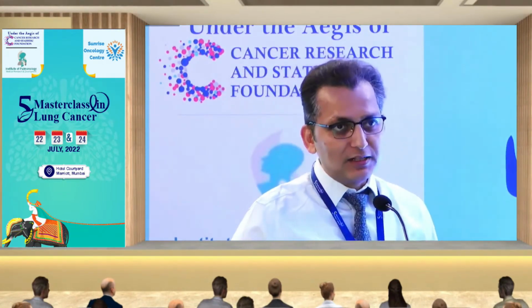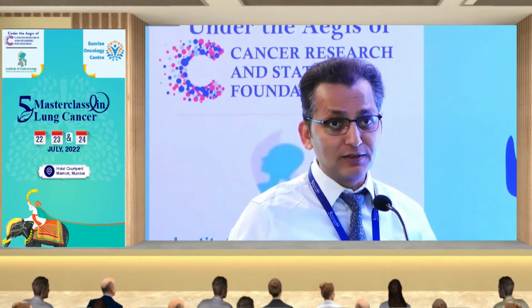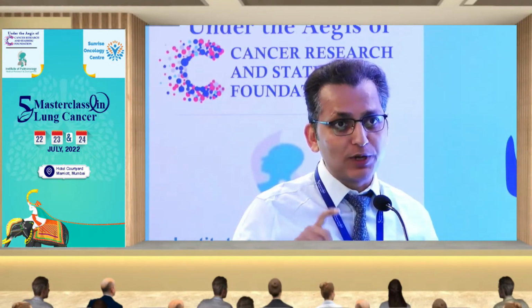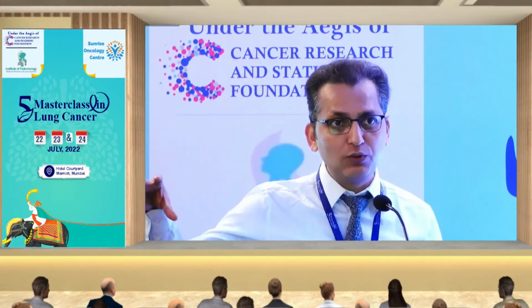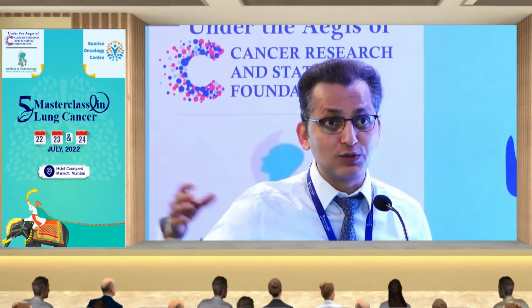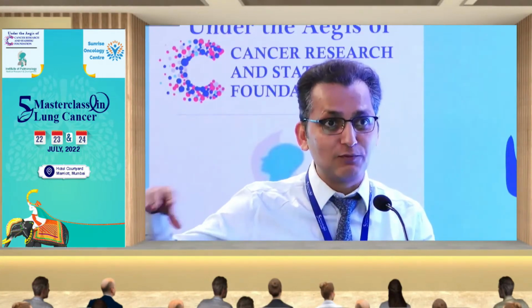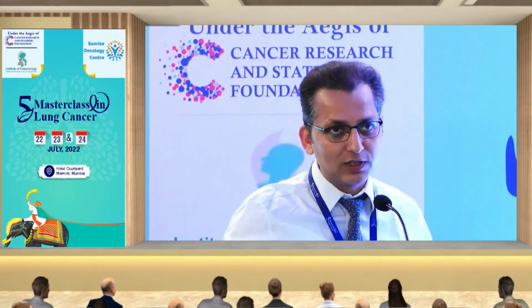No, we haven't done anything. But again, there is a study where they have done a very interesting thing in terms of SBRT. In CBCT, they were trying to predict an ITV. And when they compared that ITV to what we actually do on MIP images to generate the ITV, there was a dice similarity of more than 86. Which is very interesting actually. You don't need to do 4D CT scans and draw the tumors. You can actually do it on a CBCT itself. That is what they showed. I haven't shown it because of paucity of time. So yeah.